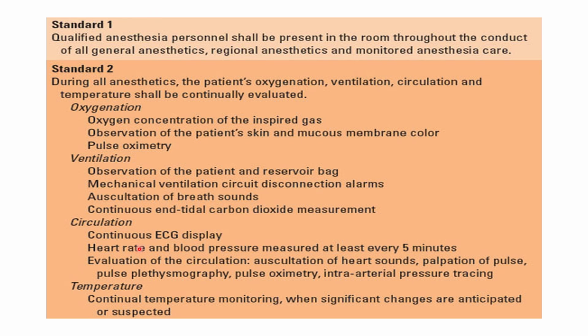The other standard is that during all anesthetics, the patient's oxygenation, ventilation, circulation, and temperature are continually evaluated. Oxygenation means oxygen concentration of the inspired gas, observation of the patient's skin and membrane color to make sure it is still pink, not bluish, and pulse oximeter.